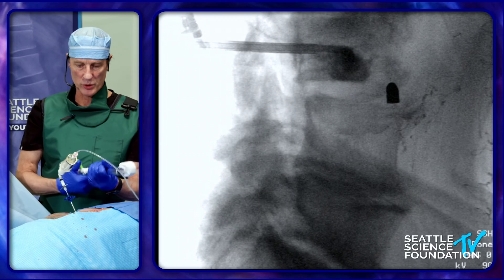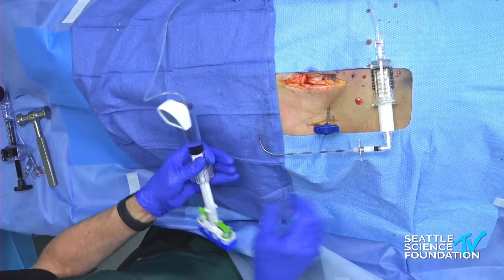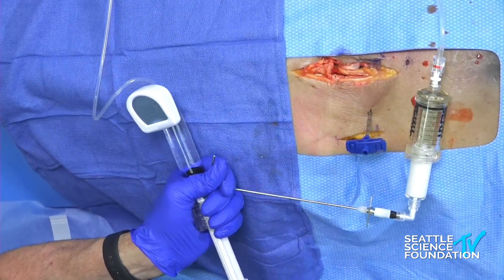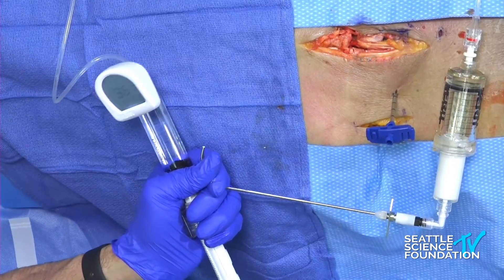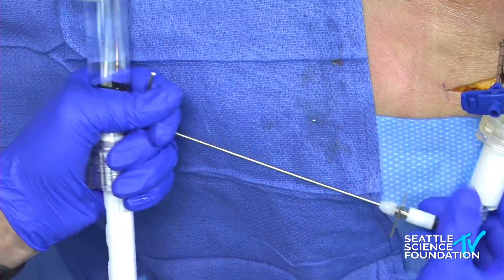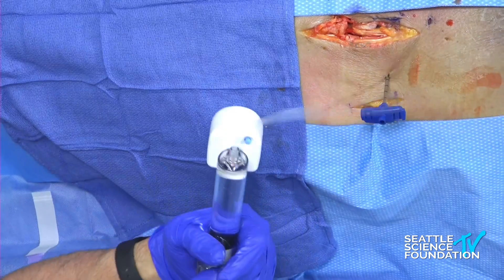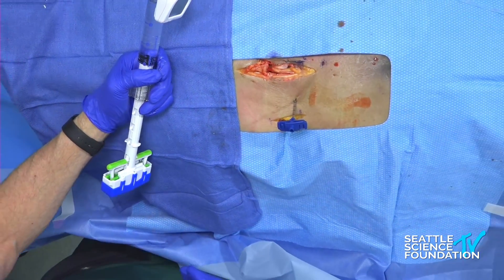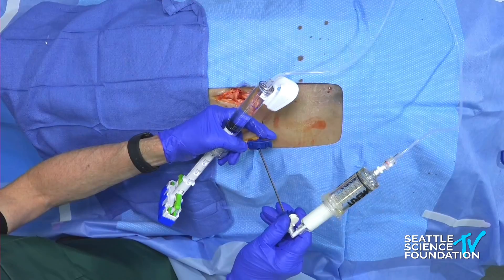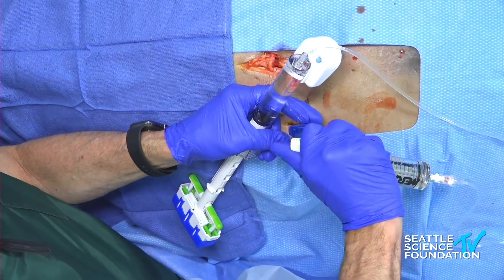A little bit of high pressure here, so I'm going to check the system. Ramsey checked it before, but I think we might have a little plug in the distal tip. Yeah, we do. I'm going to swap out the cannula. This delivery cannula is straight — it will follow the pathway created by the balloon — and it attaches here by clockwise turn.